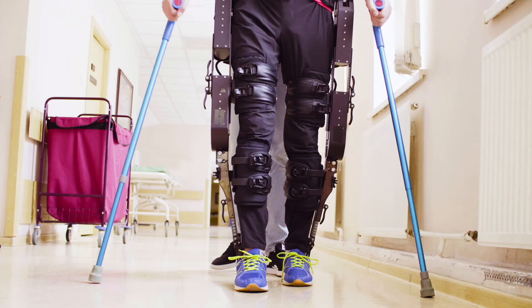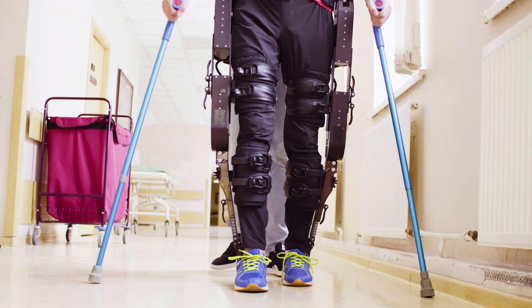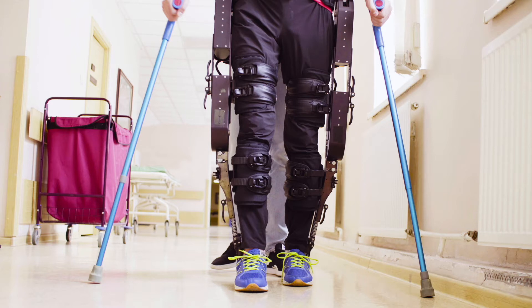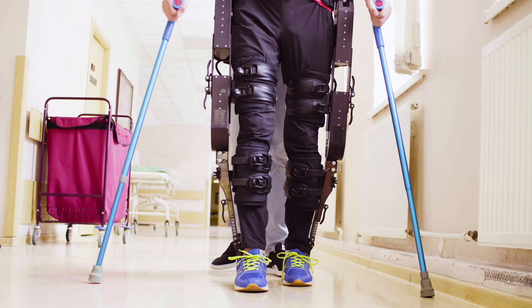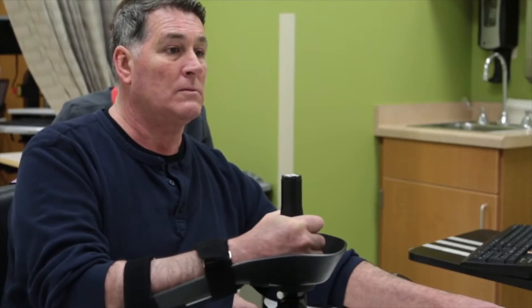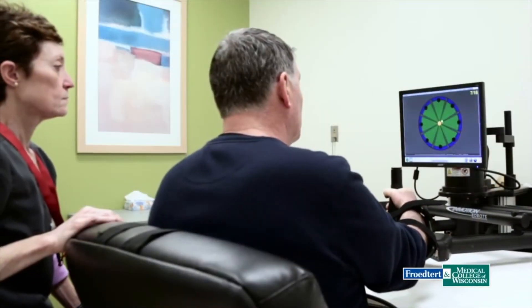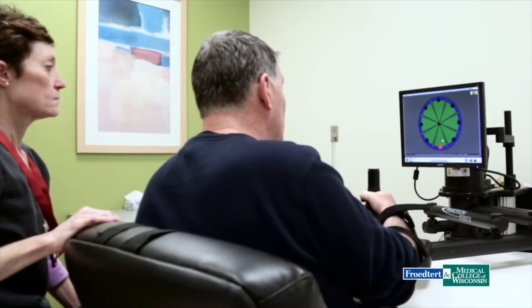For this reason, our old friends — robots — come in handy here. Robots turn repetitive, dull exercises into more challenging and motivating tasks such as games.